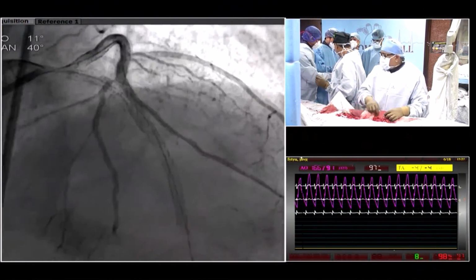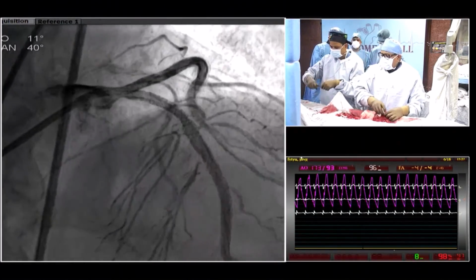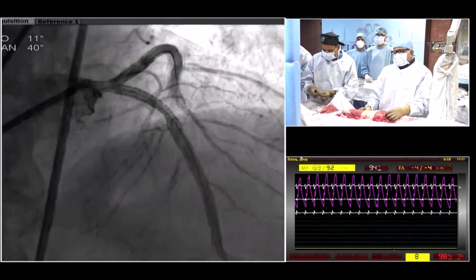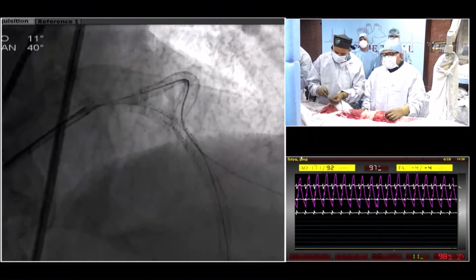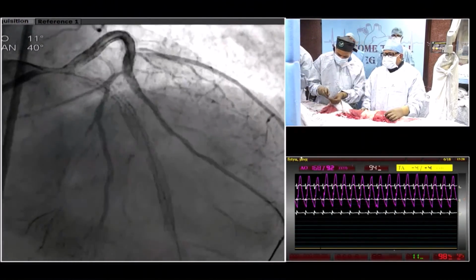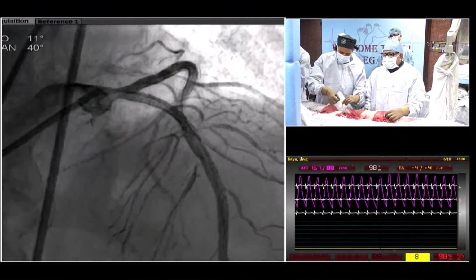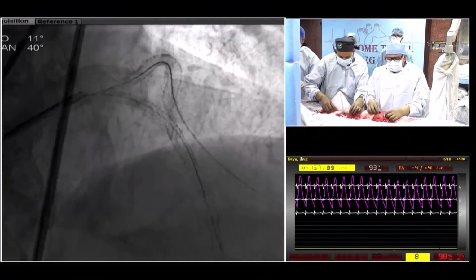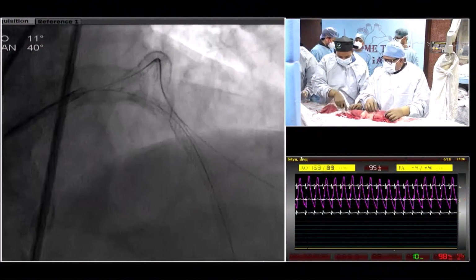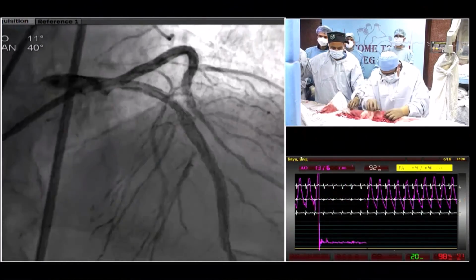Rajesh, I think since we are running behind time, we have finished our 1 hour of live transmission. So I think you continue with the work. Maybe you might have to go to a 3.75 balloon. Fine. But my gut feeling is this is not going to dilate further anymore. Well, let's see how much improvement you may try, but see to it that the patient remains safe, and whatever you could get, please show us tomorrow. Okay? Thank you very much.